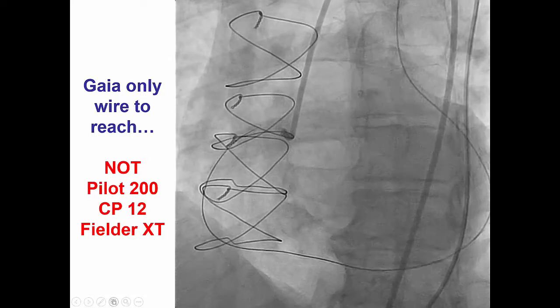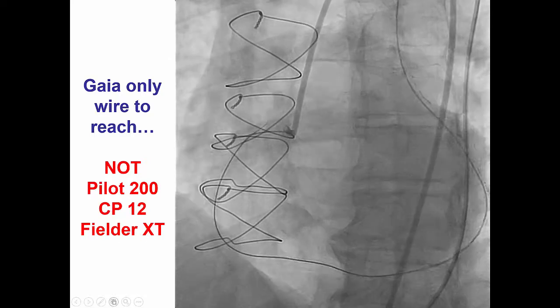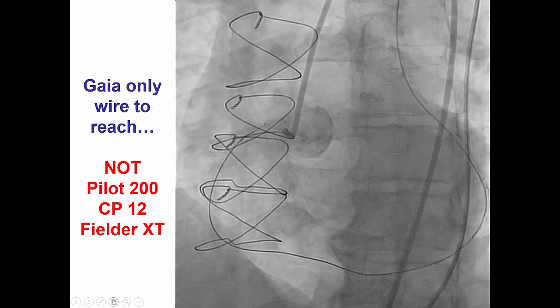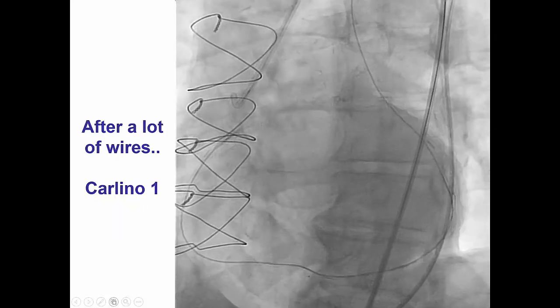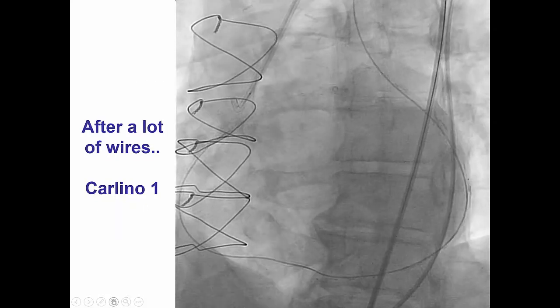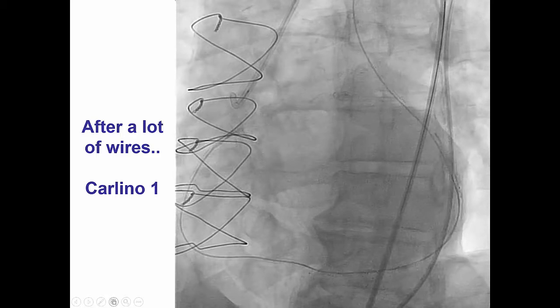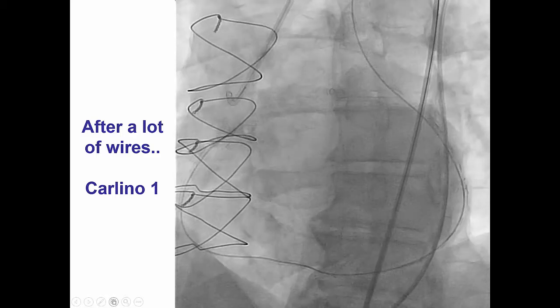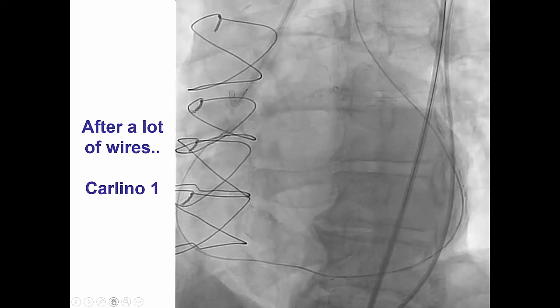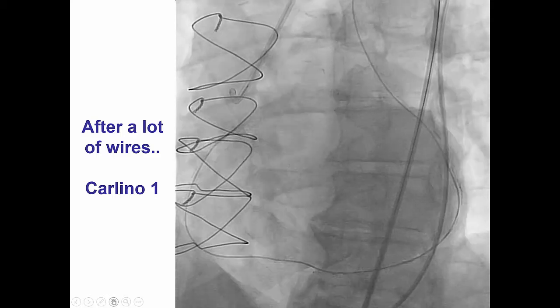When the wires came out, they were completely deformed. This made us appreciate the value of the Gaia wires, which are the only ones that would actually reach back. However, despite using the Gaia wires, we could not penetrate through.